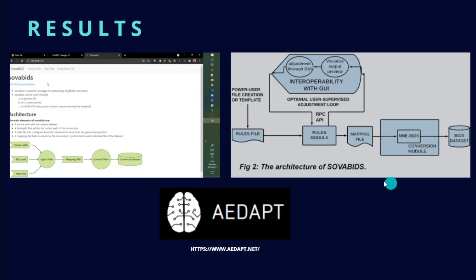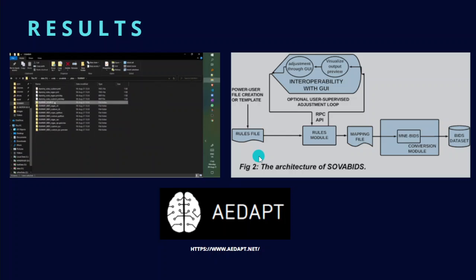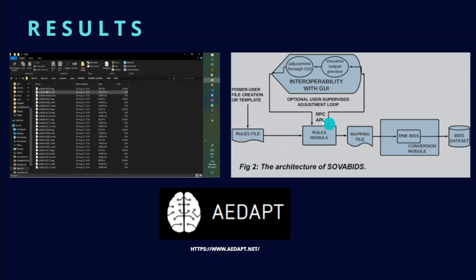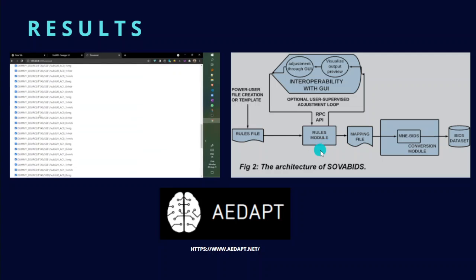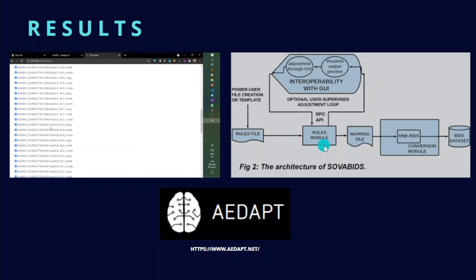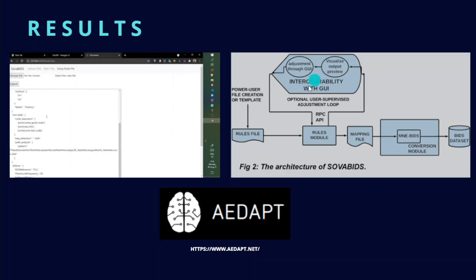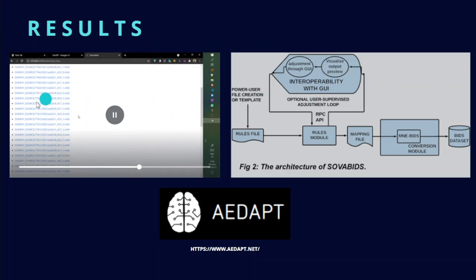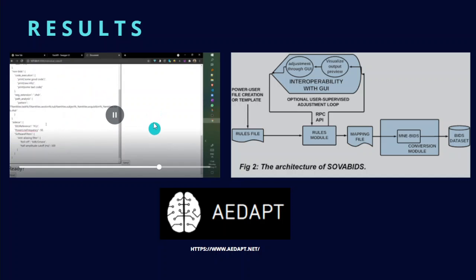The result of this work comprises an open-source Python package with two main modules: a rules module that encodes and interprets the general rules of the conversion and outputs the mappings file, and a conversion module that executes the conversion using these mappings. An optional user-supervised loop allows for manual fine-tuning for specific recordings through the interaction with a graphical user interface. An example of this is shown on the left.